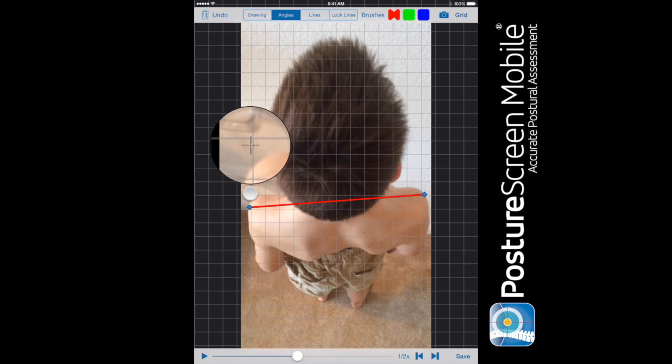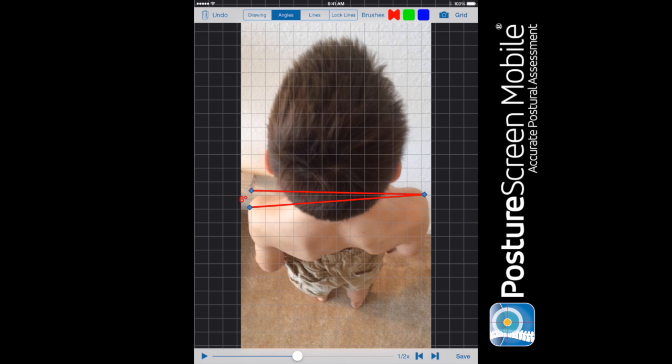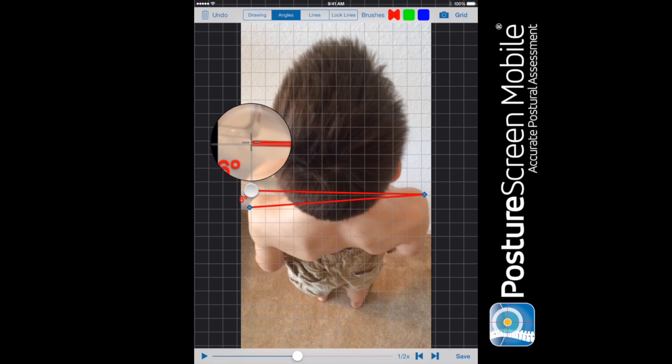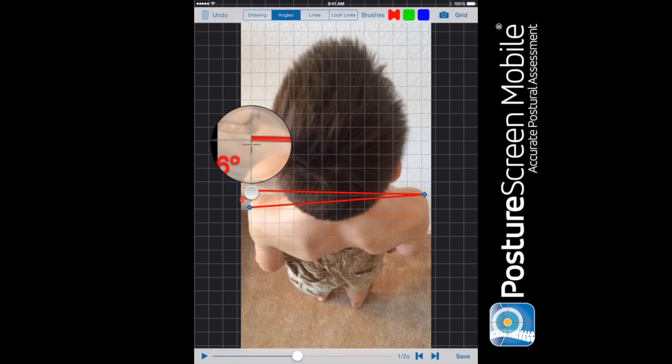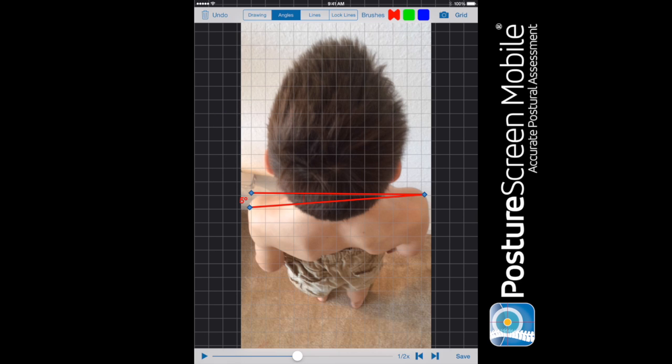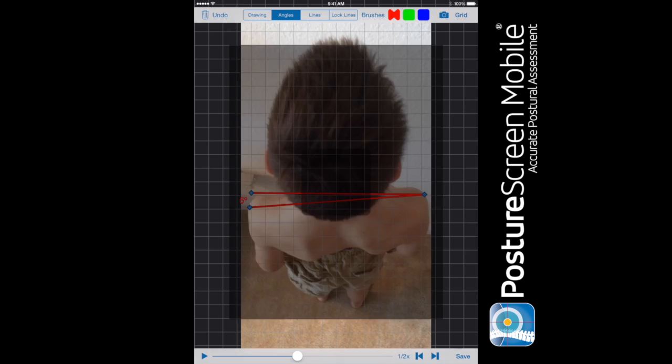And then we want to do a horizontal line and do the best fit we can. We can drag that down just a little bit, drag it down a little bit more. And then so we can see that that's about a five degree rotation posterior on the left side. So that's how you would use the angle tool.